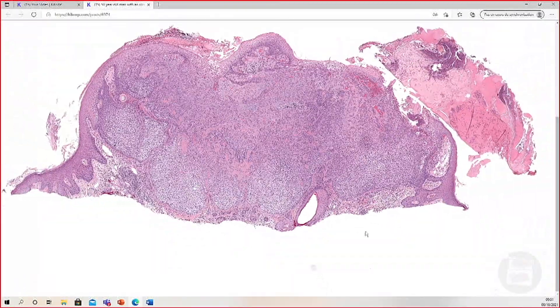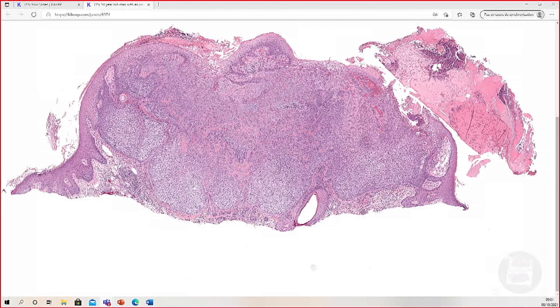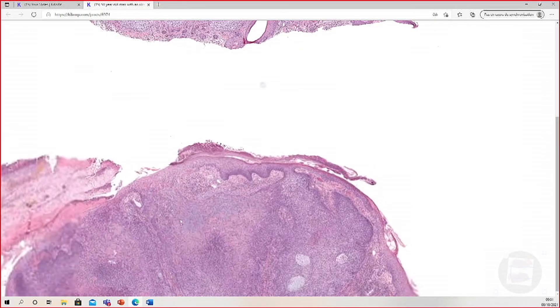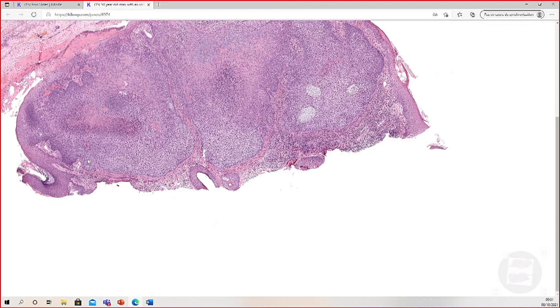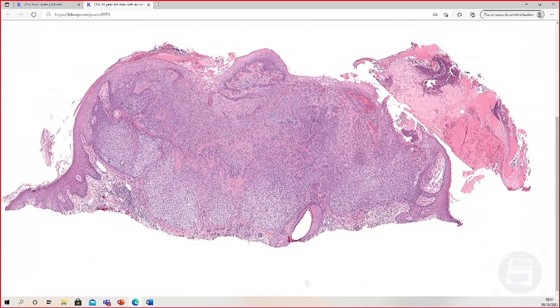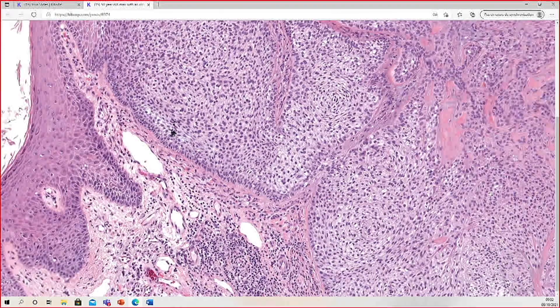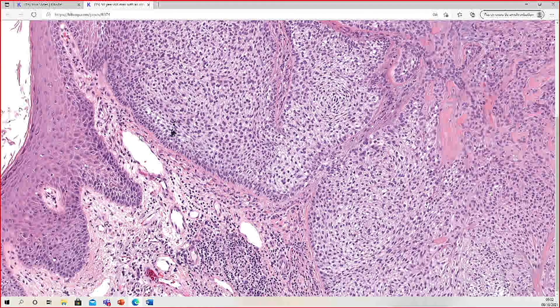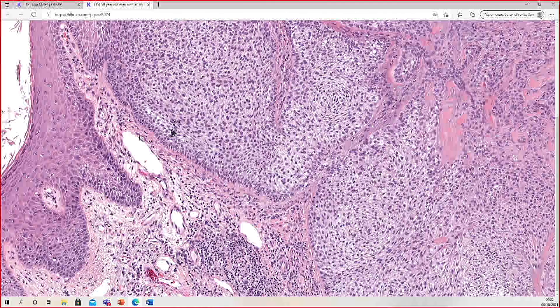Trichilemmomas are relatively common skin adnexal tumors — I see them regularly. Patients with multiple trichilemmomas may have syndromes like Cowden's, but when solitary, the majority I see are incidental sporadic tumors not associated with any syndrome. Regarding immunohistochemistry, I don't find it very helpful usually, with one exception: sometimes, if the features are not perfect, you can try CD34. CD34 will beautifully stain the basal layer because this tumor imitates the outer root sheath of the hair follicle, which often has bright membranous expression of CD34.